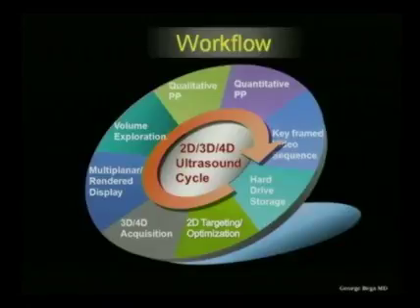So this is really the reason we call it a volume box. It's got a depth. Then we acquire a volume, typically with the lowest speed of acquisition possible. Then this information, by default, most manufacturers will display it as a multiplanar display. We would explore this volume to see if there are any artifacts inside it, as well as whether we capture the anatomical area we were after.